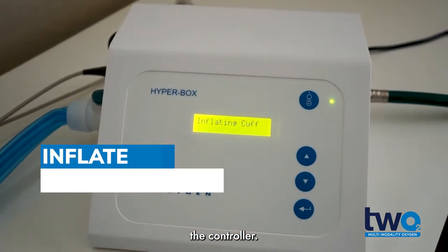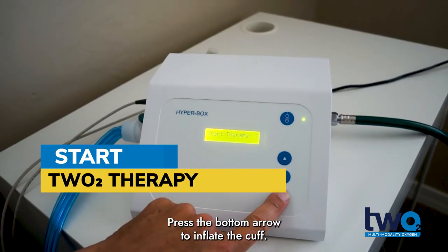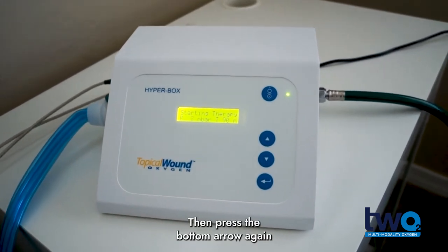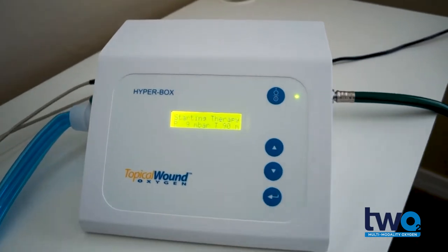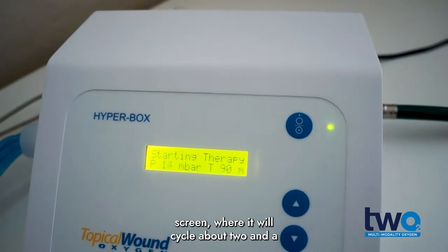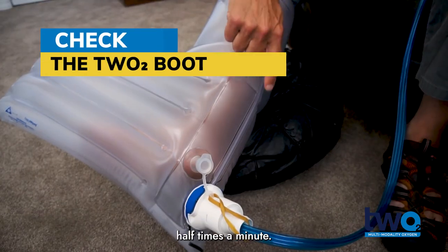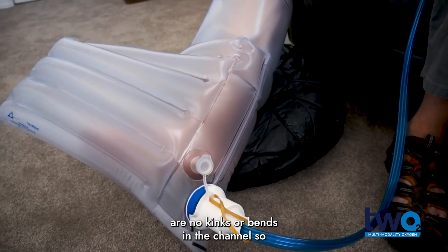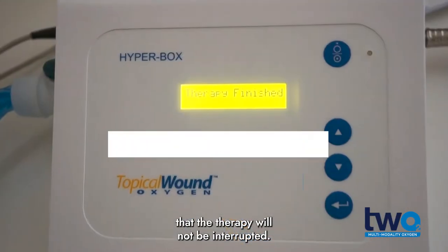Continue to follow the prompts on the controller. Press the bottom arrow to inflate the cuff, then press the bottom arrow again to start the therapy. The pressure in the boot is displayed on the screen where it will cycle about two and a half times a minute. While therapy is in progress, check there are no kinks or bends in the channel so that the therapy will not be interrupted.